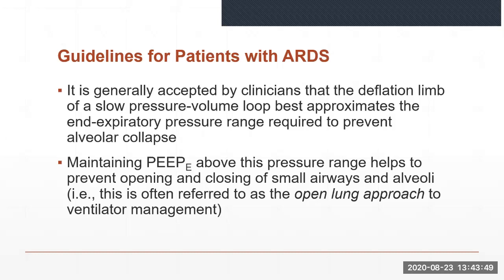Extrinsic PEEP may also be beneficial in later stages of ARDS to maintain oxygenation and reduce the FiO2 to levels of less than 50%.